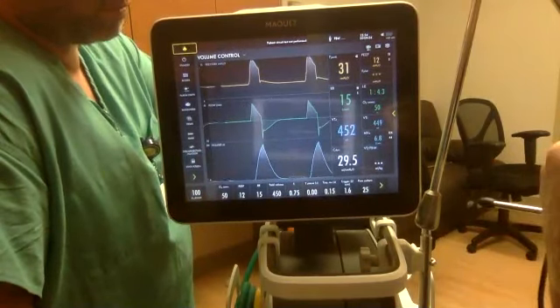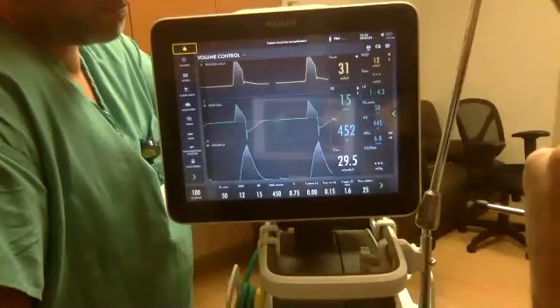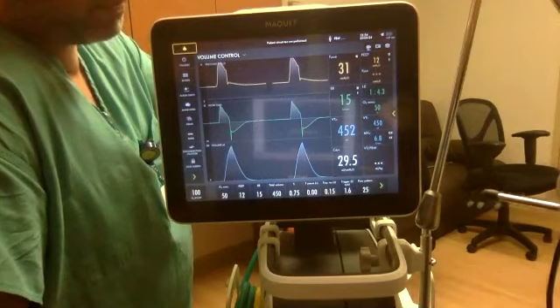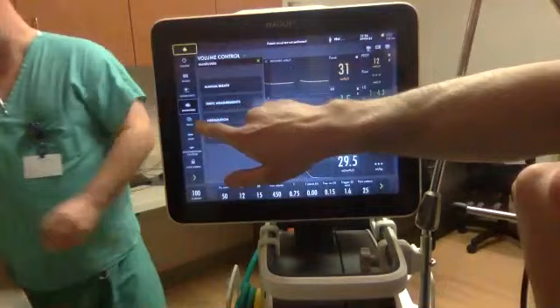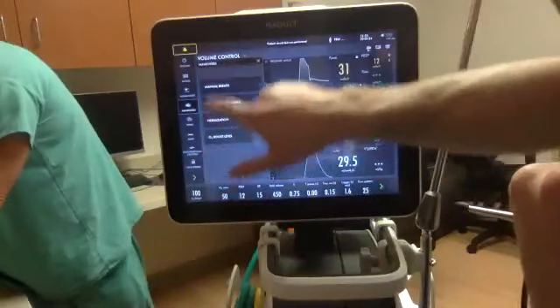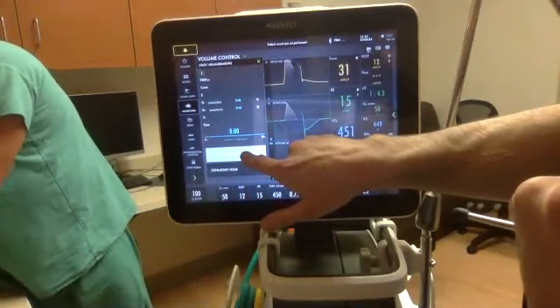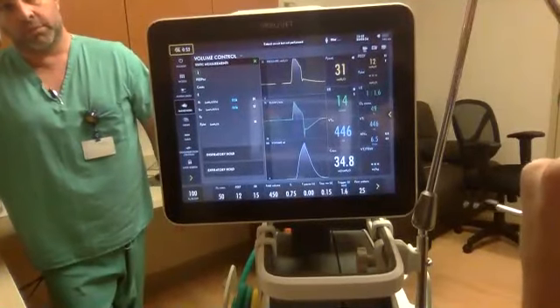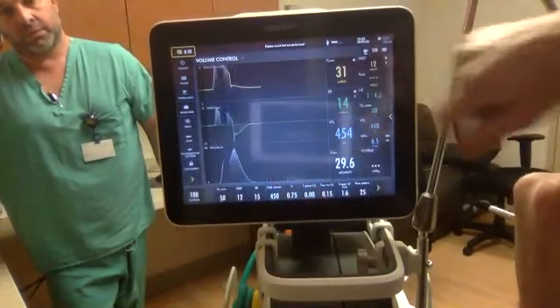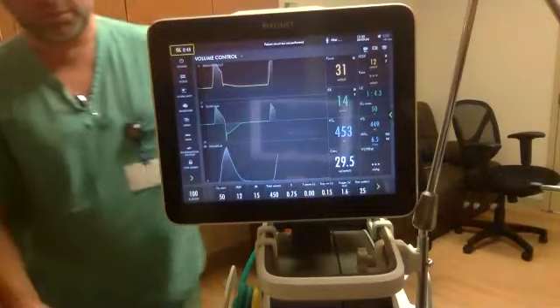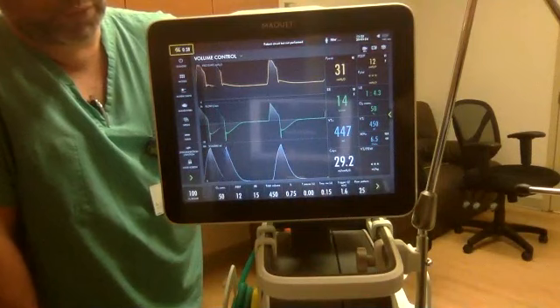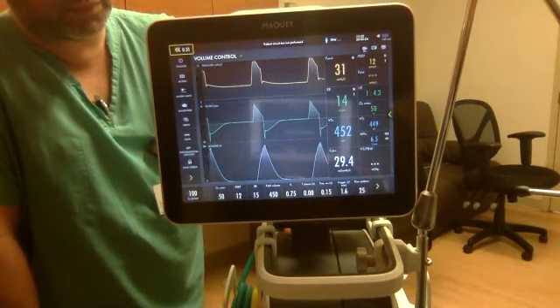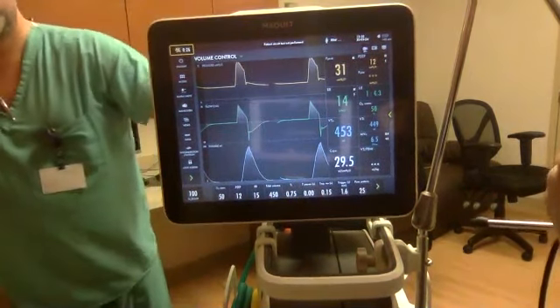To start off, ignore the flow as best you can and set it at the default. For the plateau pressure: Maneuvers on the left side of the screen, Static Measurements, Inspiratory Hold — hold until you hear the beep. Right now it measures 25. The target is 30 or less. I want to thank both Dr. Spiegel and Eric Kreiner for joining us. We'll transition to answering additional questions. Please stay on if you'd like and we'll open it up. Thanks so much to Rory and to Eric — this has been fantastic.